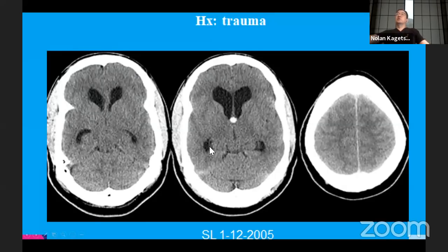Some of my diagnostic radiology colleagues make fun of neuroradiology, saying it's just symmetry. You just compare one side to the other, and that's the abnormal side. And I kind of jokingly say, yeah, unless the finding is symmetric.